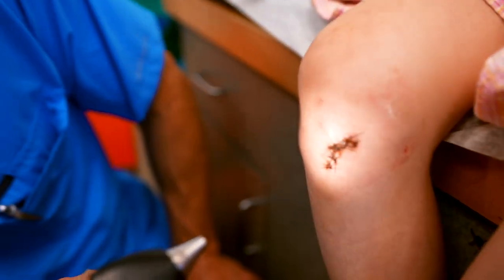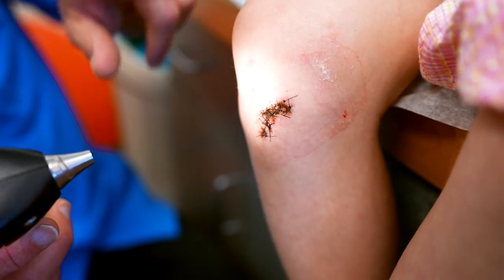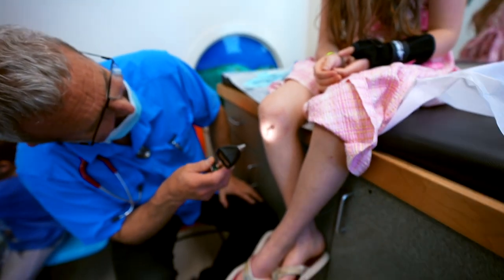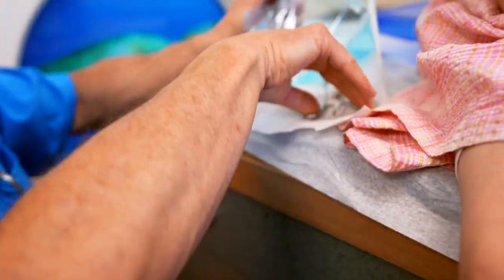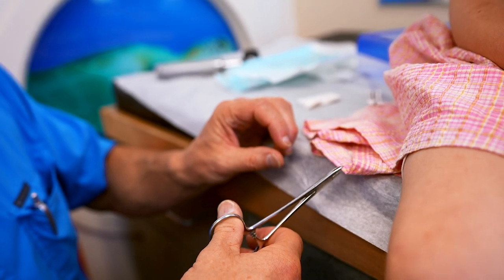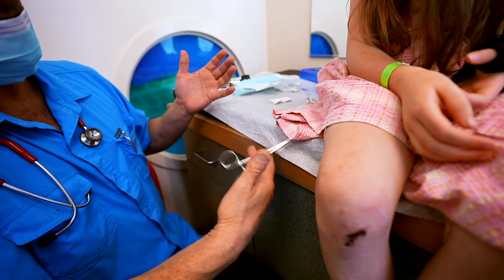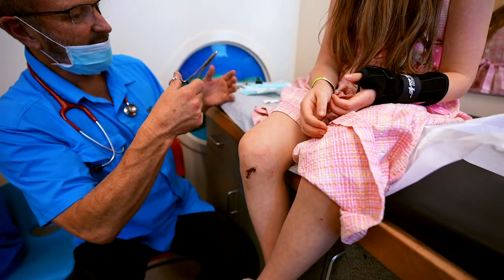There's always the decision of how long do you leave stitches in. And when it's near a joint like this — we walk, so we put a lot of pressure there — 12 to 14 days is probably about right. There's a little needle holder here, actually. I don't know if it's gonna work. You see how I can grab your dress here? And just let it go and it just hangs on? That's what I'm gonna do on your stitch. So it's not gonna hurt — I'm just gonna clip it on the stitch.